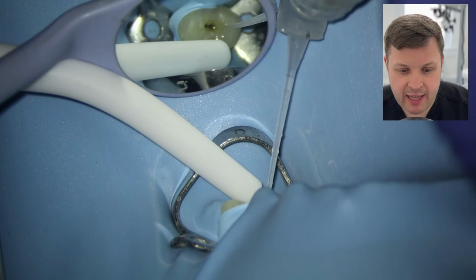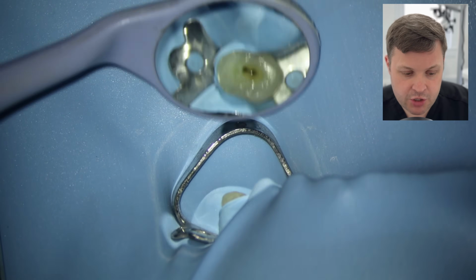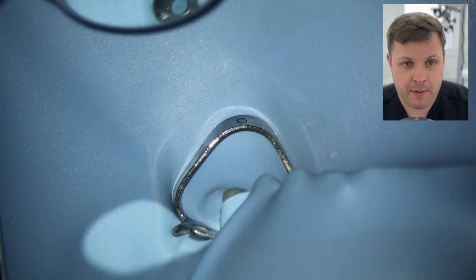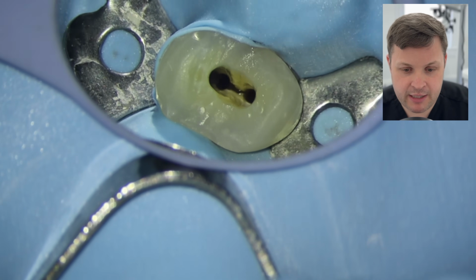And don't forget, I really struggled to get to the end here. So what I'm not going to do is push these rotary files too hard to length. I'm just going to do a couple of pecks, pull it out, irrigate, recapitulate, a couple of pecks, and we can see now that it all looks really nice.